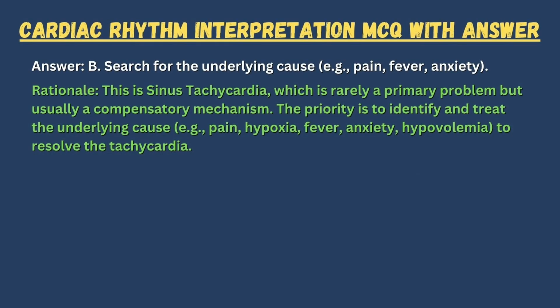Answer. B. Search for the underlying cause, for example pain, fever, anxiety. Rationale. This is sinus tachycardia, which is rarely a primary problem, but usually a compensatory mechanism.